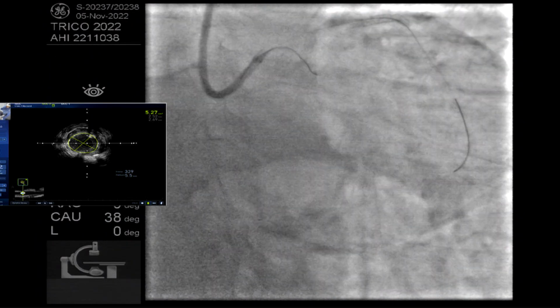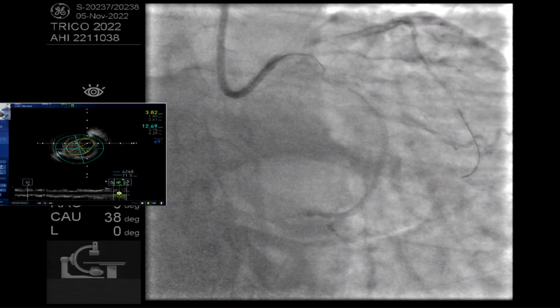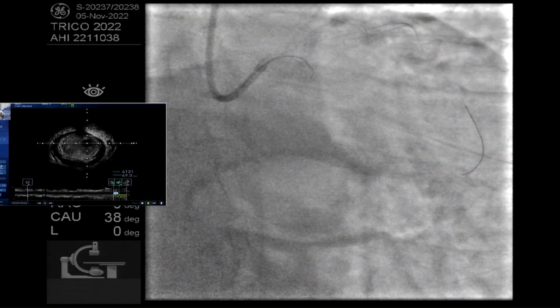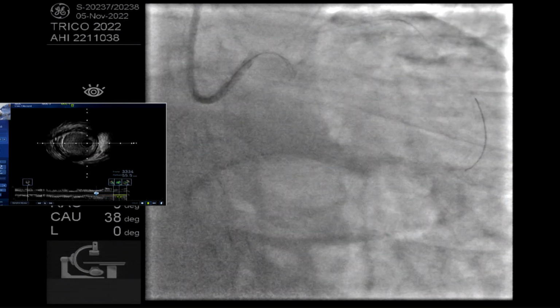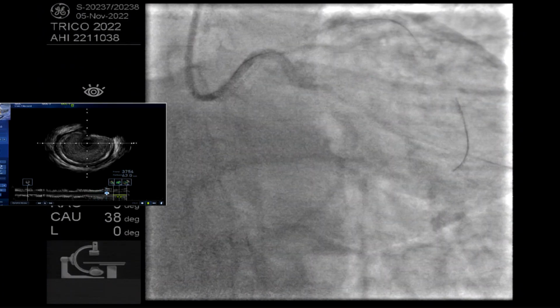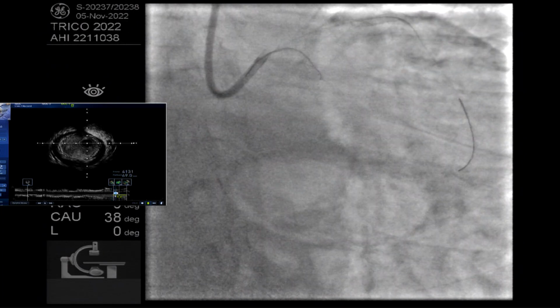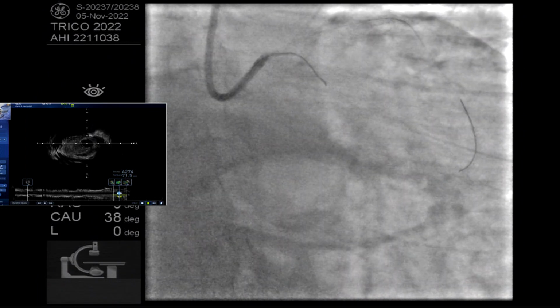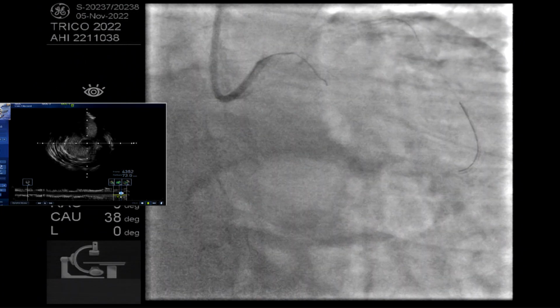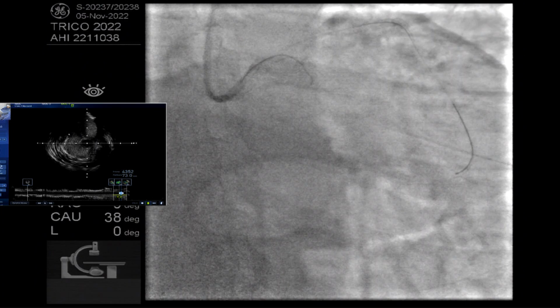And the previous question, we will move to the LAD. Can you see the IVUS, right? Okay, very difficult. I'm just putting back to the proximal LAD, right? Here is the landing zone, I hope. And this is the just proximal LAD. You have lots of disease, right? Here and here, right? Here is a CX.